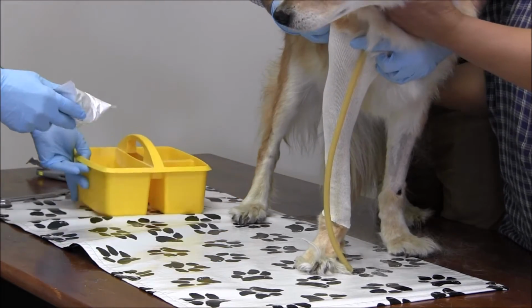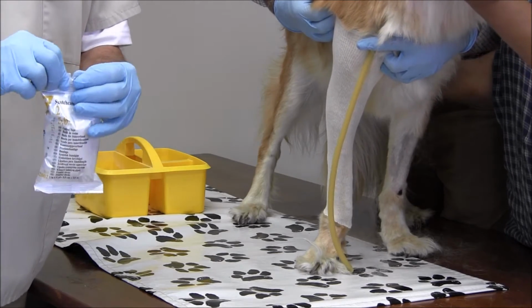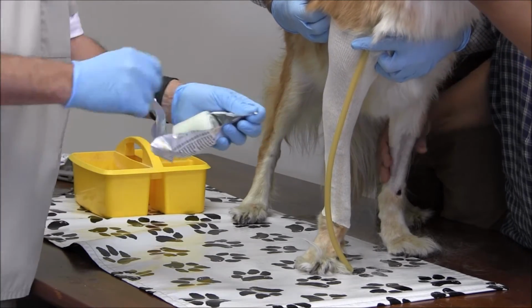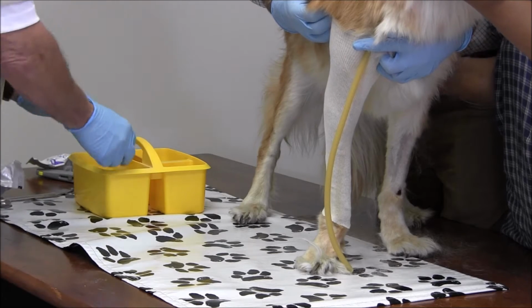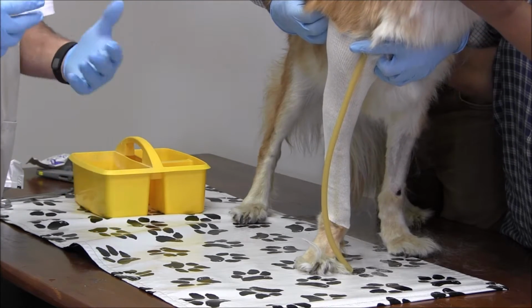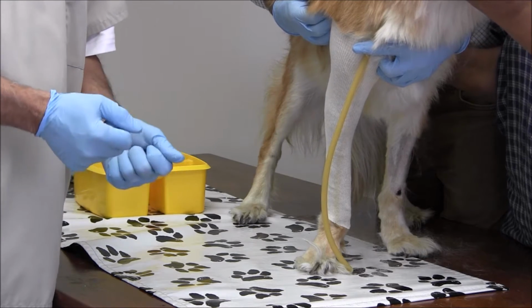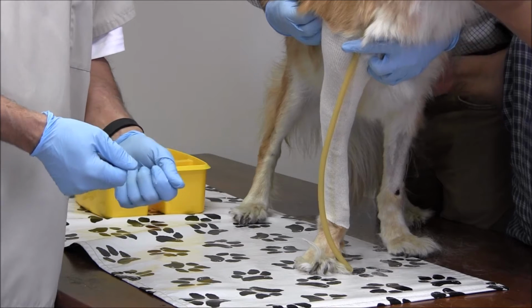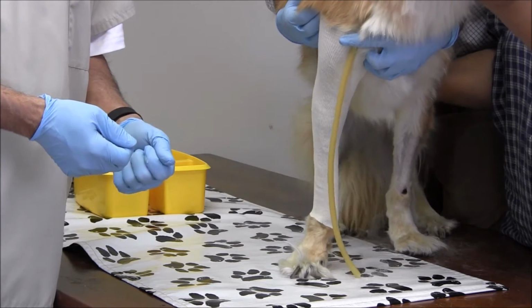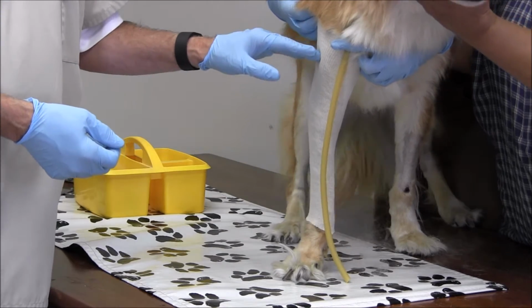When we cast, in this case we're going to use 2-inch fiberglass casting tape. We're going to open it up and we're going to leave it in the water for about 10 seconds. After it's in the water for about 10 seconds, we're going to go ahead and squeeze it out 3 times to get the water out, and then we can start wrapping. We're going to start wrapping distally and move our way up proximally.